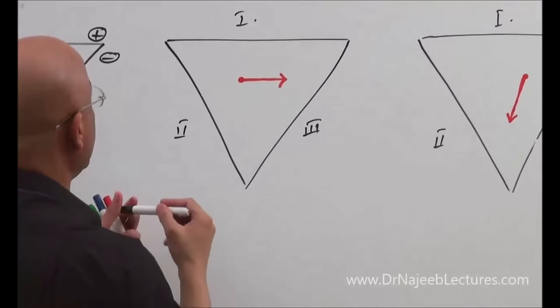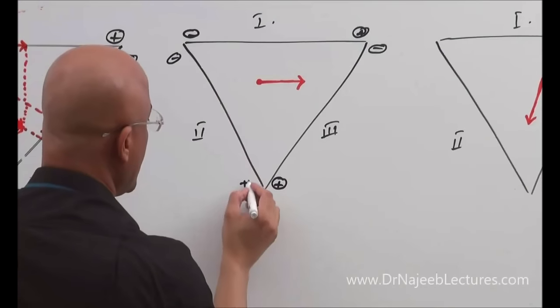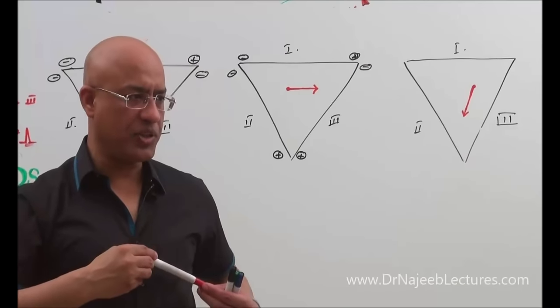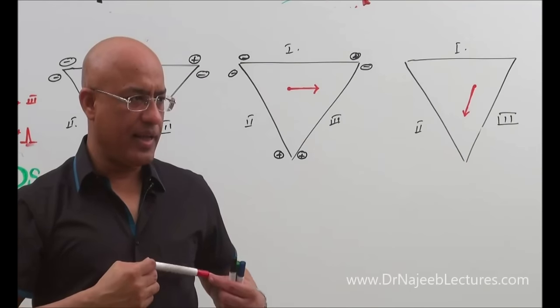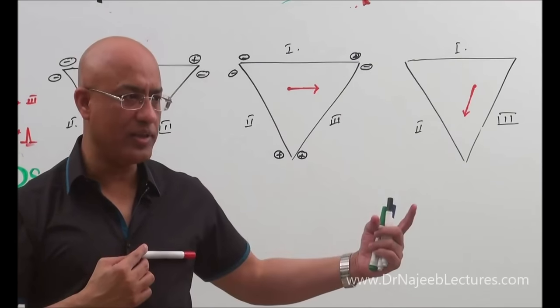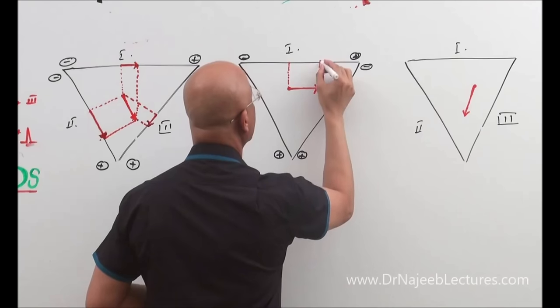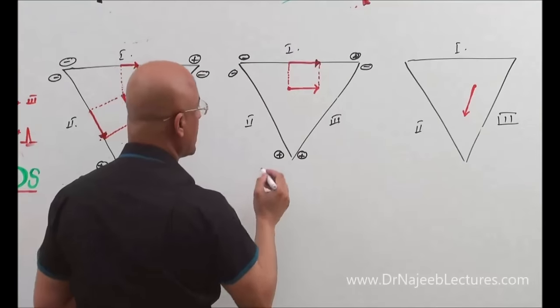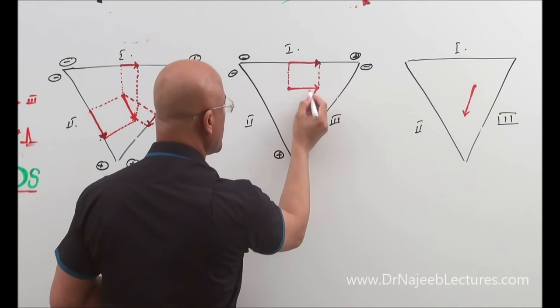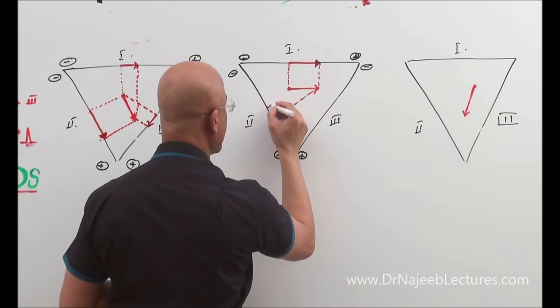Here again we need to put it, negative, positive, negative, positive terminal electrode. Let's suppose, rather than the electrical vector being directed downward and leftward, hypothetically, due to some disease condition, it is moving from right to left, then it becomes very parallel to lead 1. Now, maximum projected vector magnitude will be along lead number? One. Right? But now we have to see the projected vector along lead 2. What happens? We have to take a perpendicular here and take it to the tip of the vector and the tail of the vector.